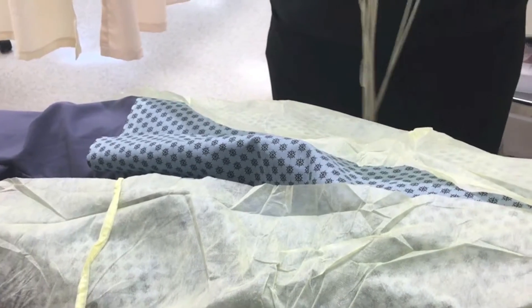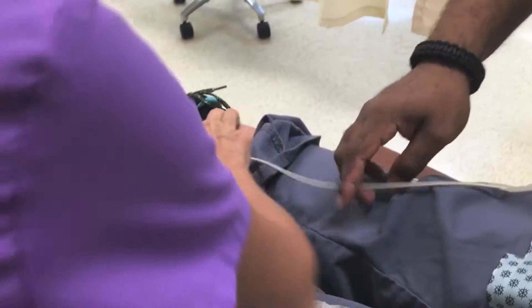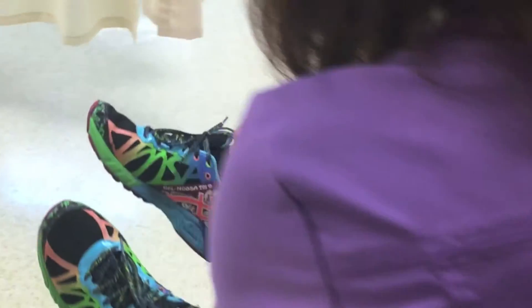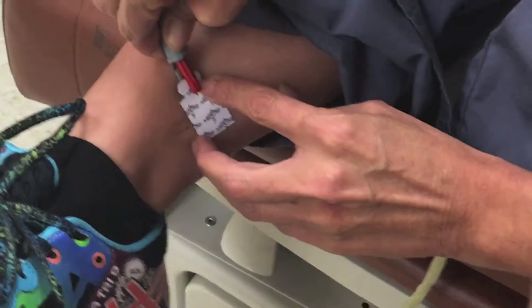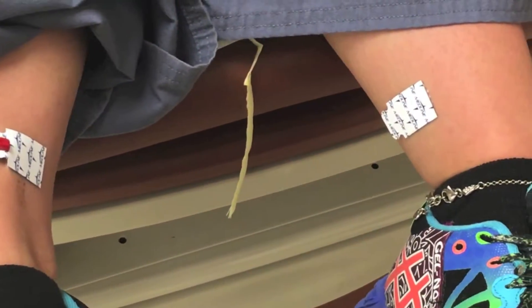Now I need the right leg. That would be — is that the RA? This would be the RL. And this one is also RL. So this one's the left and this is the right. I want to hook up the right part. See, the little prongs just stick right to the sticky tab — it's almost like jump-starting a battery.